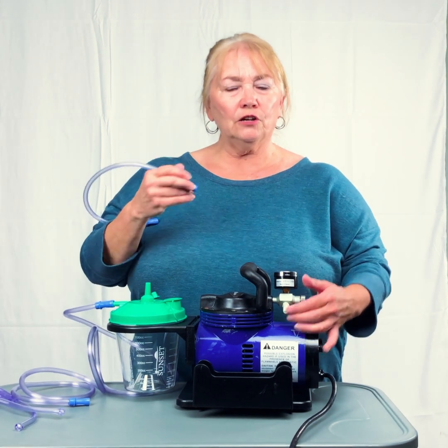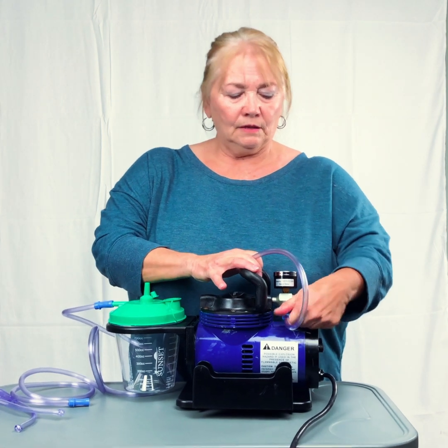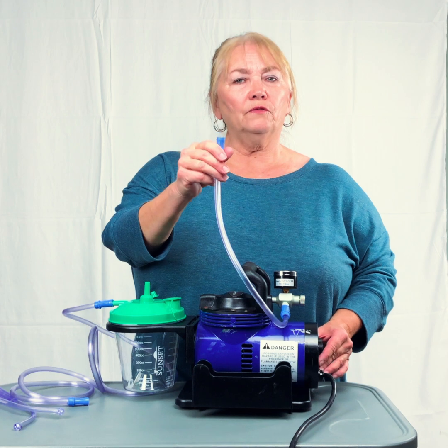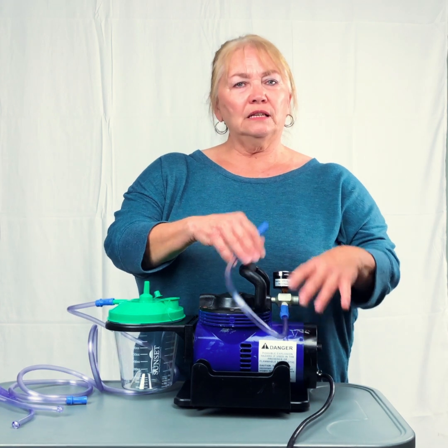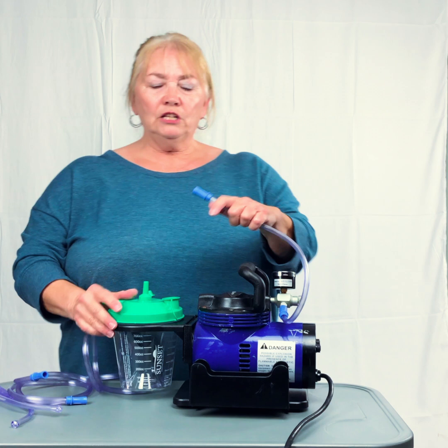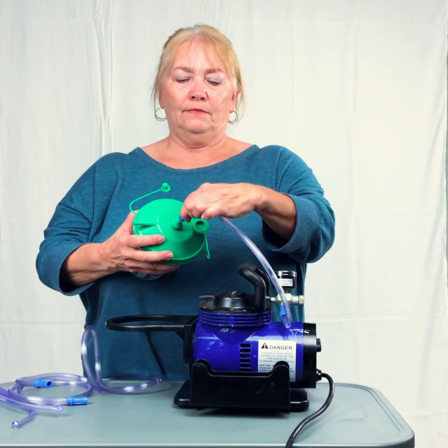We had suction here, so then we're going to hook up our short tubing. We turn the machine on and put our finger over the other end. And we have suction. Again, I know it's not the machine, I know it's not this piece of tubing. The next thing we're going to do is hook it to the top of the canister, the short piece.